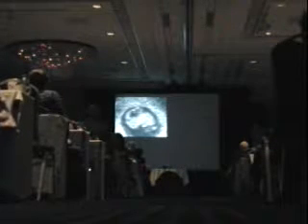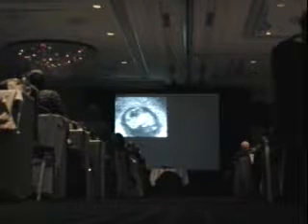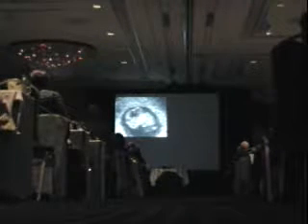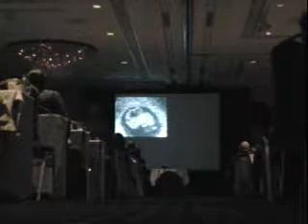Now, this is a fetus that came in at about 8.5, 9 weeks, as a routine size and dates. And there were two things here that bothered me. First of all, the rhombocephalon, which is normally cystic, was a little bit too big for the size of this fetus. And there was also a bump on the back here that really was not normal. This should be nice and smooth. There should not be that bump on the back.